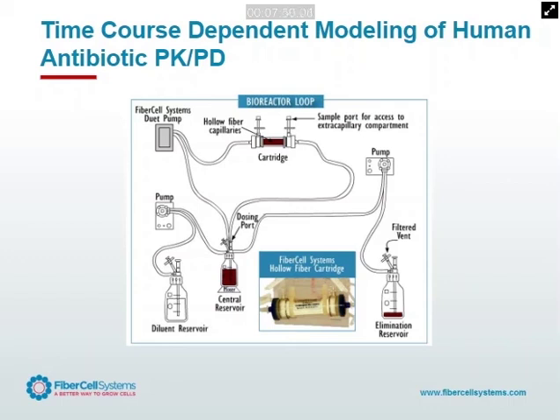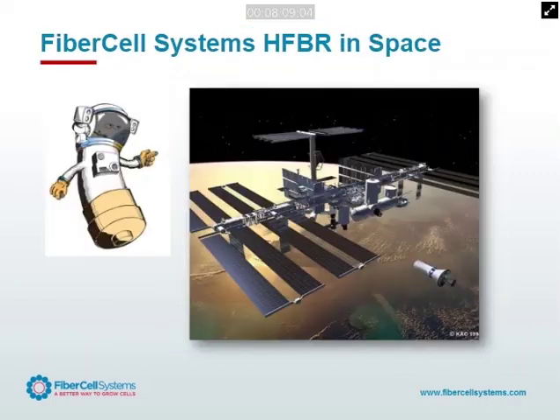It's also a good way that we can do time course dependent treatment of cells, lots of cells as well. For example, one of the things that we do with mesenchymal stem cells and exosomes is we want to look at heat shock. So we can just take the central reservoir and put it into a 45-degree water bath and try doing that with 200 flasks at one time. So this is also a way of doing time course exposure of various treatments to cells in a very defined and physiologically relevant fashion.